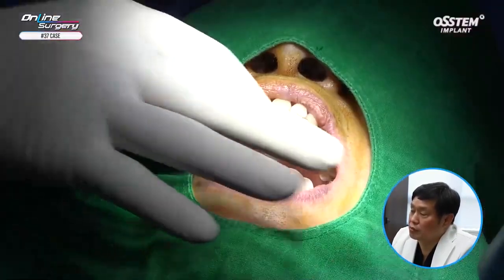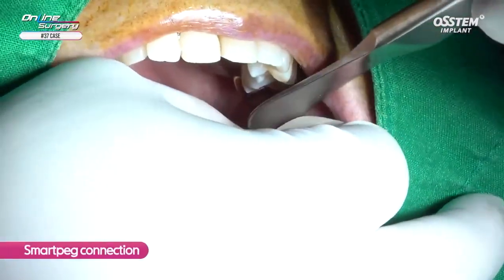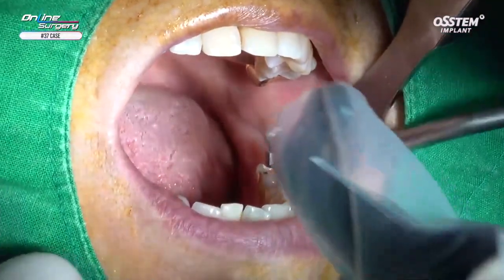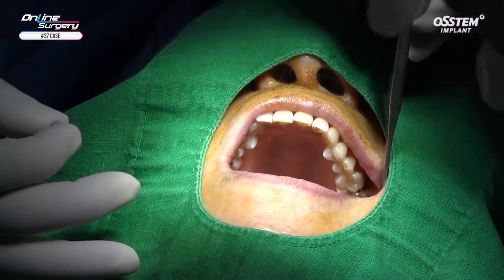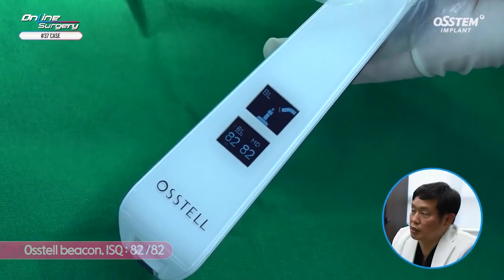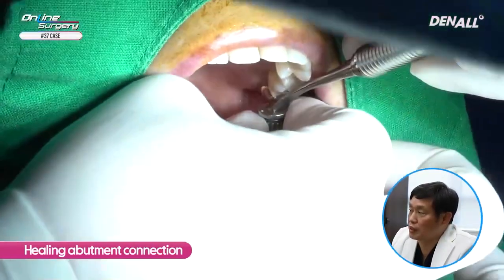Implant has been placed as shown. Primary stability is good. Healing abutment was connected and surgery was closed.